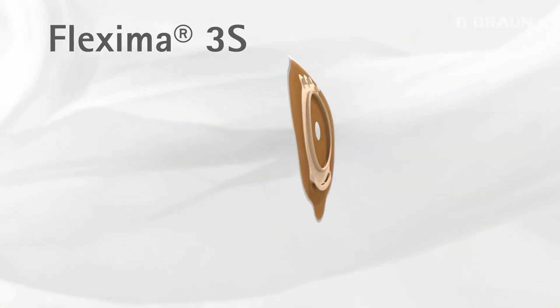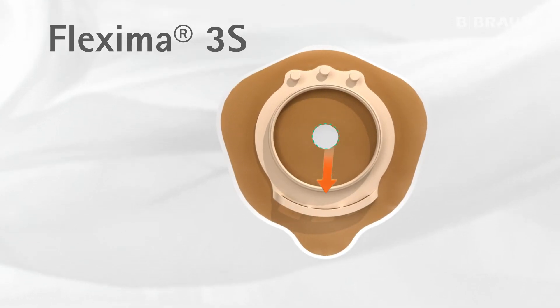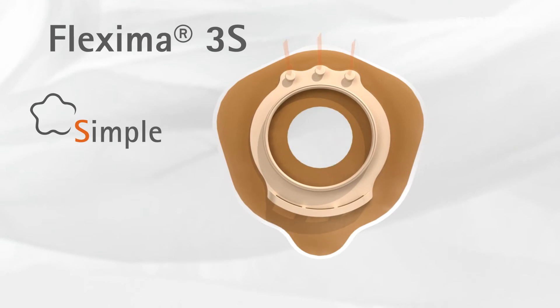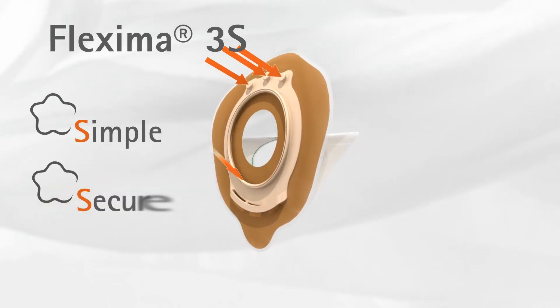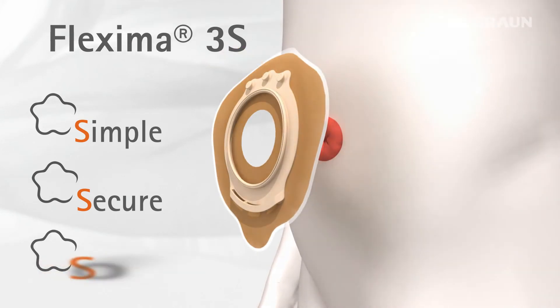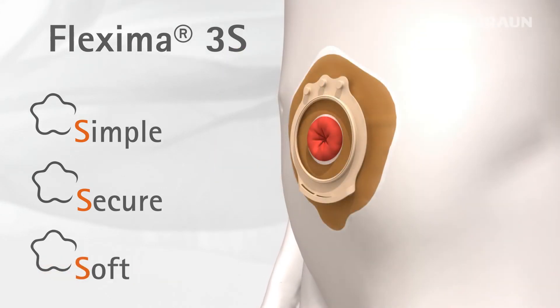Flexima 3S stands for three clear benefits: Simple, with correct positioning from the start; Secure, thanks to the double security system; and Soft, very comfortable to wear.